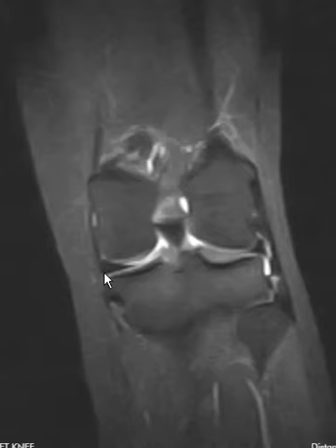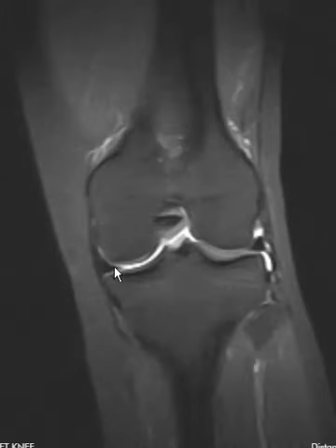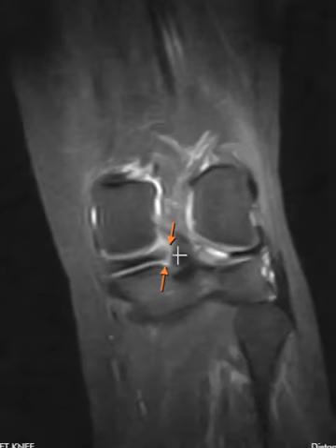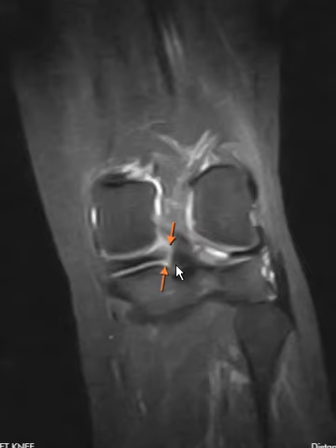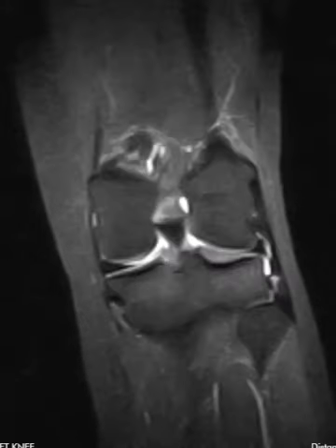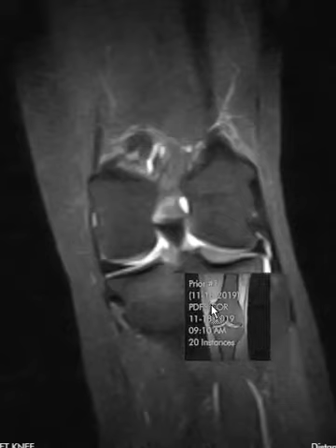On the current examination here we have these coronal STIR images, and we look at that meniscus again — here's the medial meniscus body, looks great. There's no pseudo-extrusion, and back over here we do see a vertical band of fluid signal right at the medial meniscus root detachment. Normally it'll go over and attach right down here, but this is a root tear — really easy to miss because sometimes you only see it on one image.